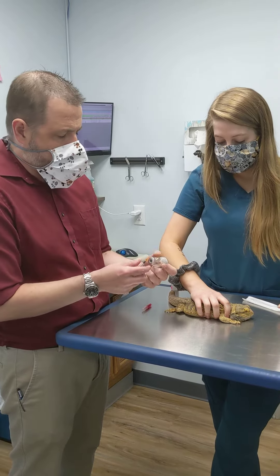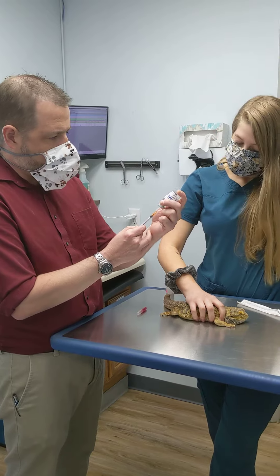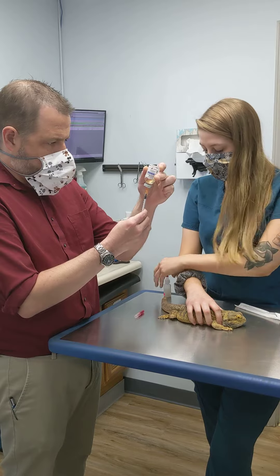We're going to show you how to do an injection in a bearded dragon. Reptiles — it's not uncommon that we will send them home on injectable medication. What we're going to do first, we need to draw up the medication.